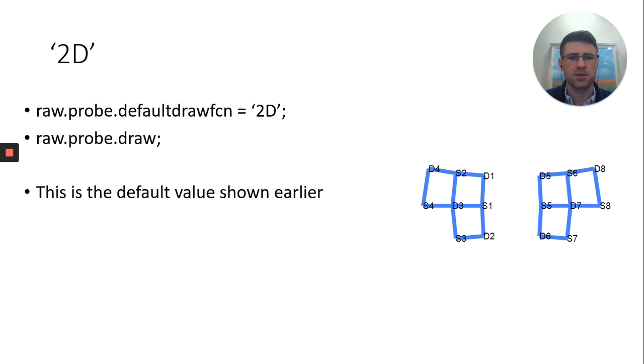And then finally, the last option you have is 2D. But if you recall, when we first wrote raw.probe.draw without specifying the default draw function, we got this output. So the default draw function, if you don't specify it, is two-dimensional. Very little information, but it does give you the rough idea of where everything is. It does have labels on it. You see S1, S2, S3, S4, D1, D2, et cetera. So this is very simple, very straightforward, how you would actually go to draw the probe in the NIRS toolbox.